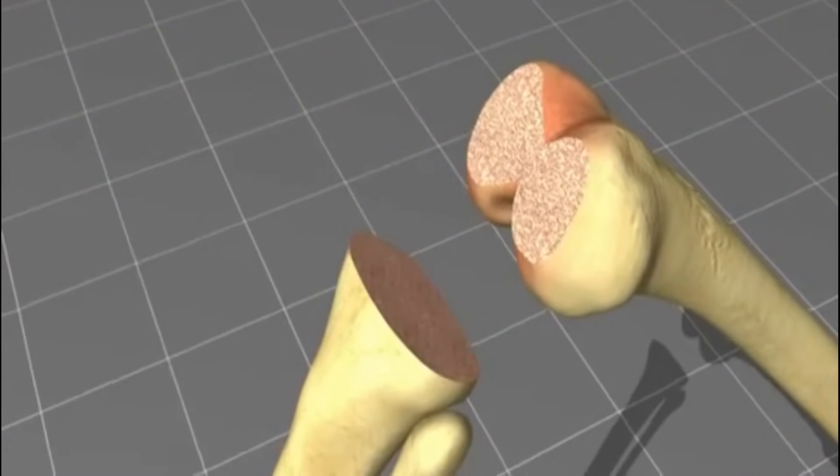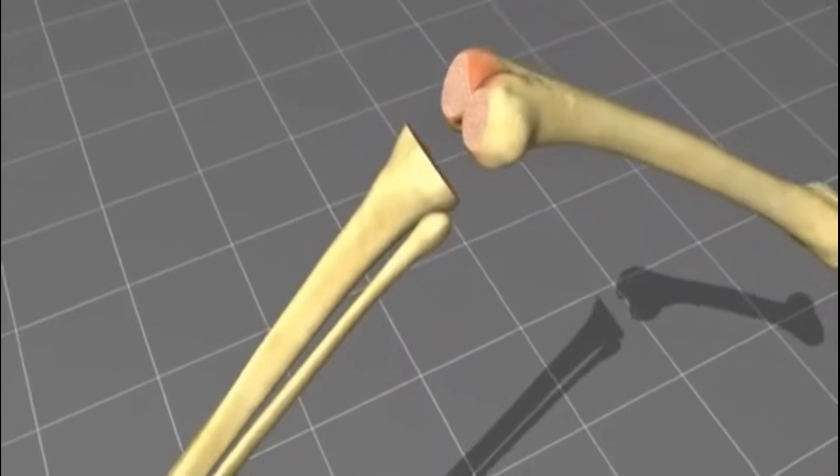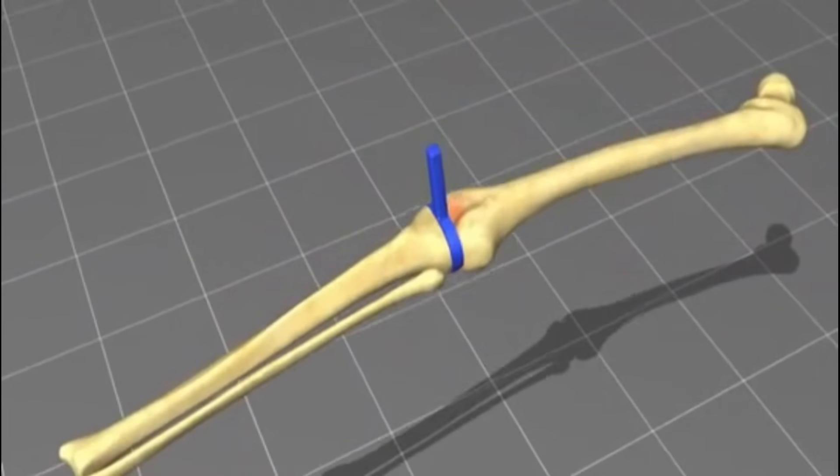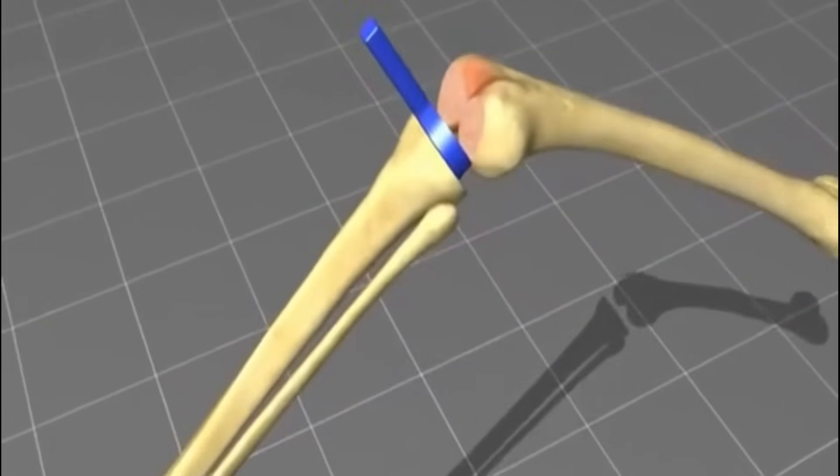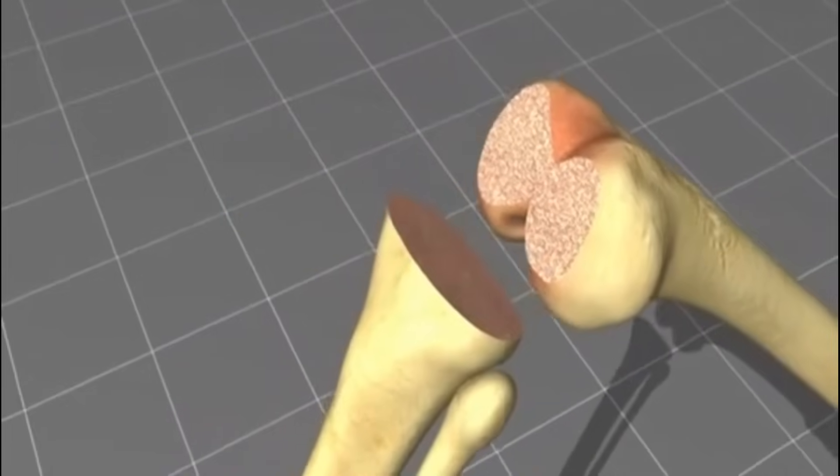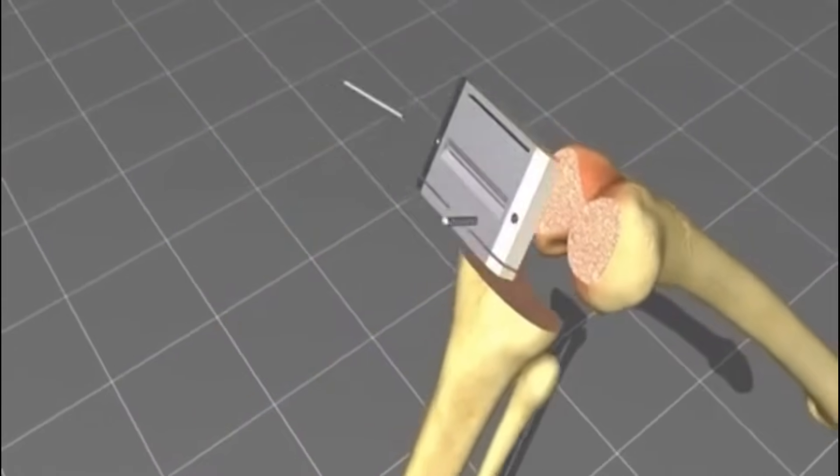Now, the knee is taken into full extension. A spacer block is positioned and the knee alignment and the extension and the ligament tension is checked. Also in 90-degree flexion, this spacer block gives me the later position of the femoral component.